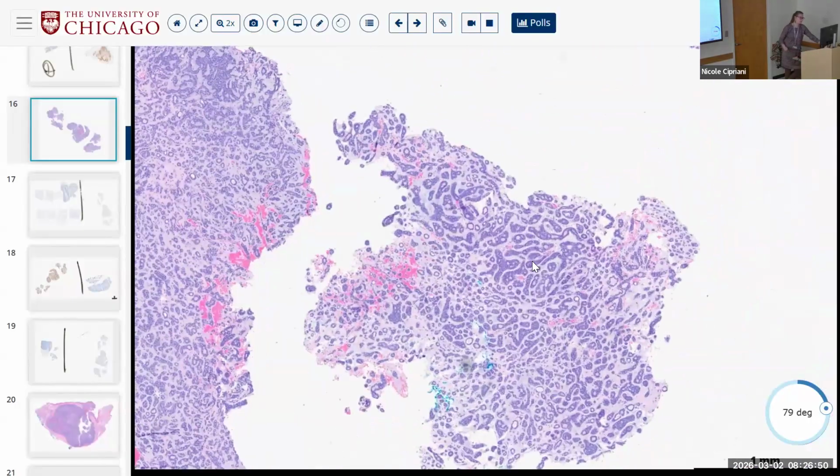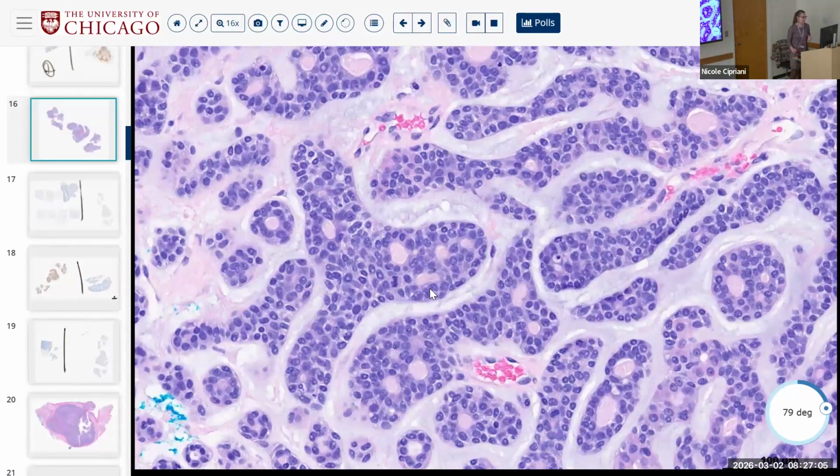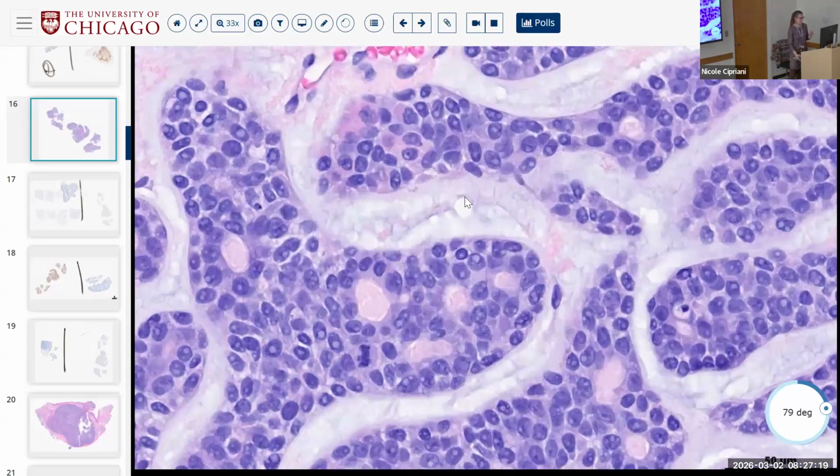Exactly, right? So a very, very blue basaloid thing with pale bluish mucoid stromal material and these tubulo-trabecular or cribriform spaces, and there's a mitotic figure. That should at least raise adenoid cystic very high, right? Because that is the most common tumor that has these combinations of patterns, the tubules, the trabeculae, and the cribriform, with this myxoid matrix.